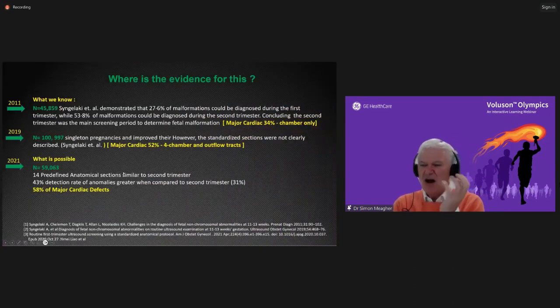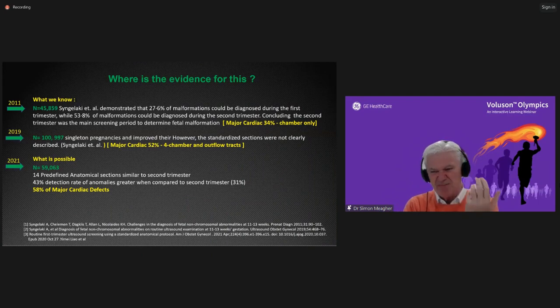So you say to me, okay, Simon, look, really, should I be looking in 2023? And the answer is absolutely yes. And if you look at it over the last 10 years, you see back from 2011, where detection rate was about a third, we're now moving into the arena where detection rate in 2021 is about two-thirds. And these are three huge population studies. And you can see progressively over the last 10 years that the detection rate of cardiac malformation is improving.